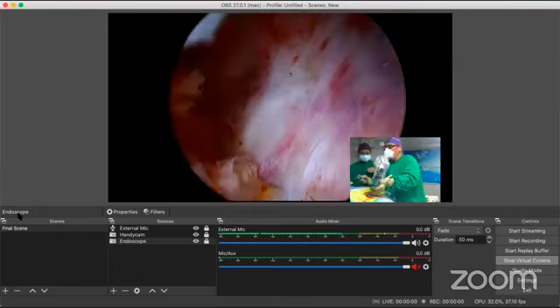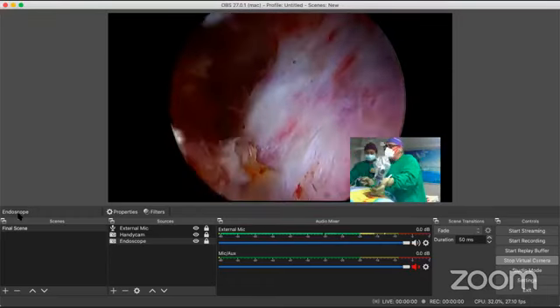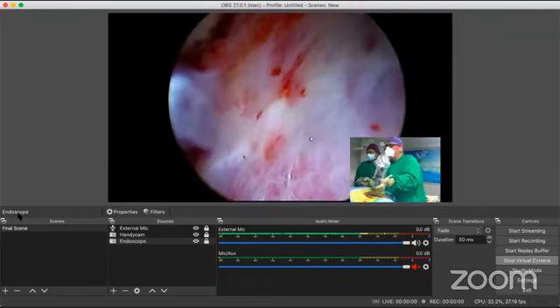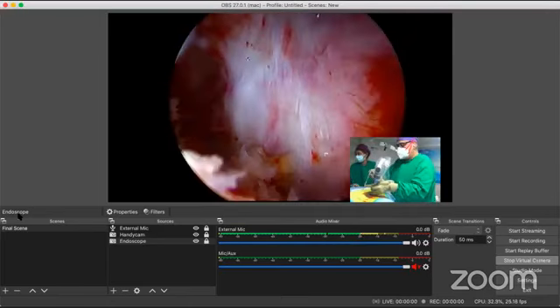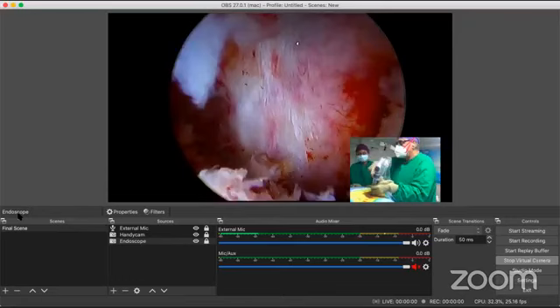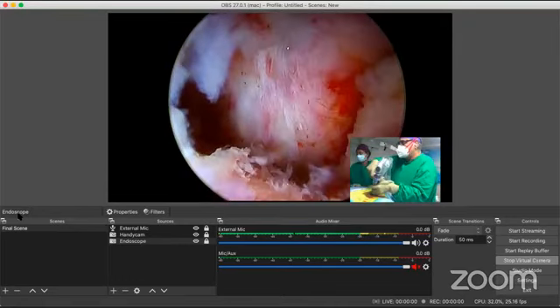See your root, the whole root is opened up. You can see how the myelin is. And you can see the osteophyte below also, which we'll show you now after some time. But first, give me some time to just clear up a little bit more.